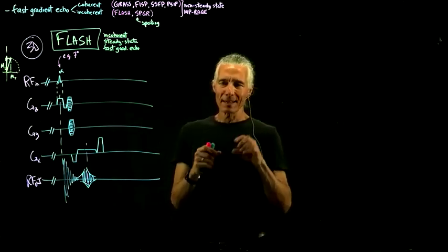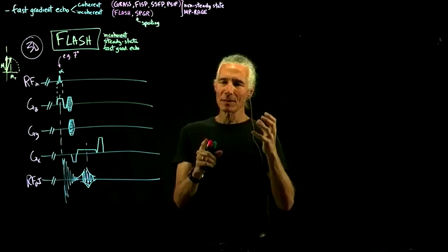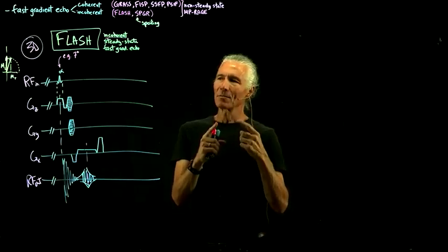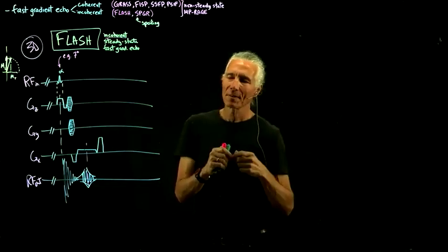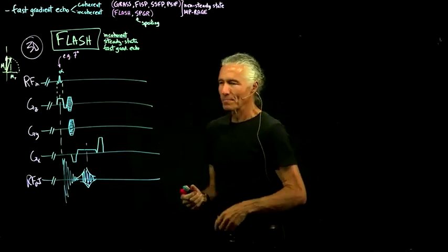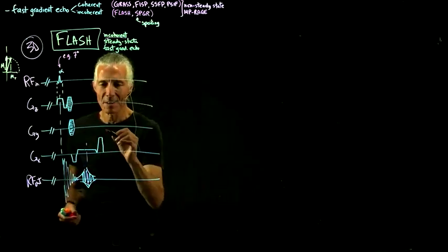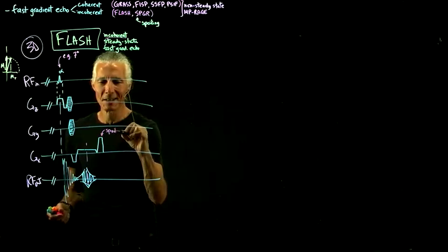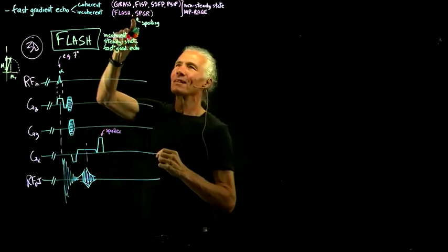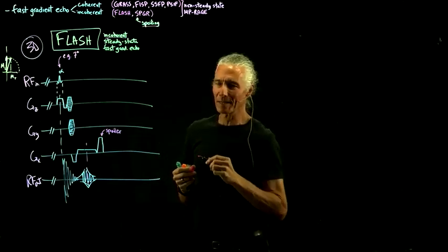That's like a really T2 star. It really reduces the signal from it, because as you wrap it up, more and more cancellation occurs because everybody's out of phase. And so you can think of that as, you call this a spoiler. And so what you're doing is you're just trying to spoil the magnetization, just mess it up, any leftover magnetization.